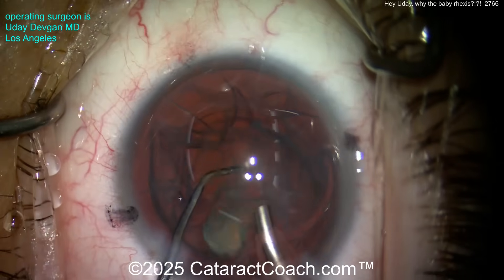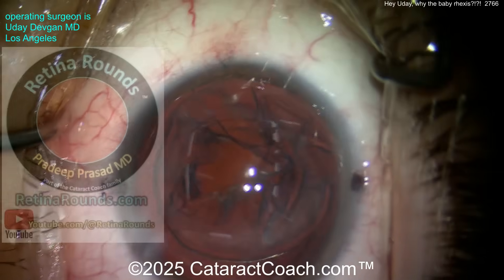Beautiful — aspirate, aspirate, aspirate. Not very dense, just had that central nuclear opalescence. Now let's come on out.